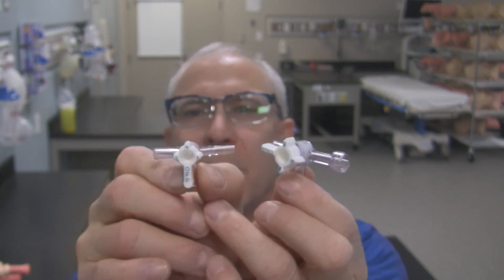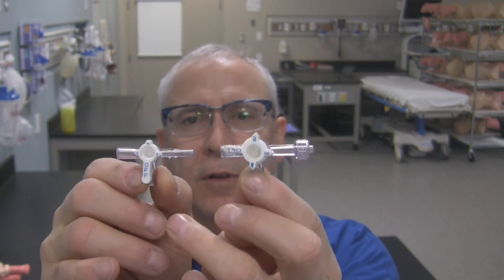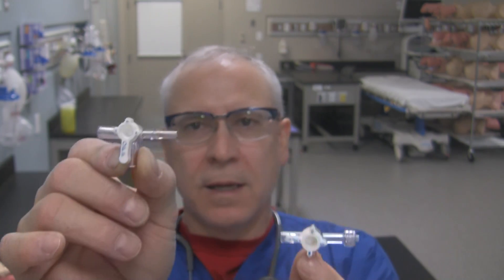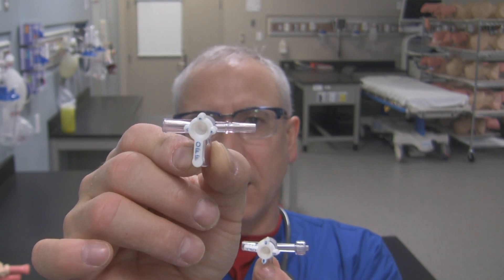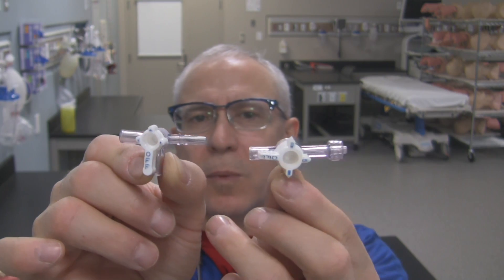Now they're very similar but there is a subtle difference between the stopcocks. If you look at this one, it has a male end luer lock to it. This one has a male end non-luer lock but slip style male end to it. So let's take a look at these stopcocks in a bit more detail.